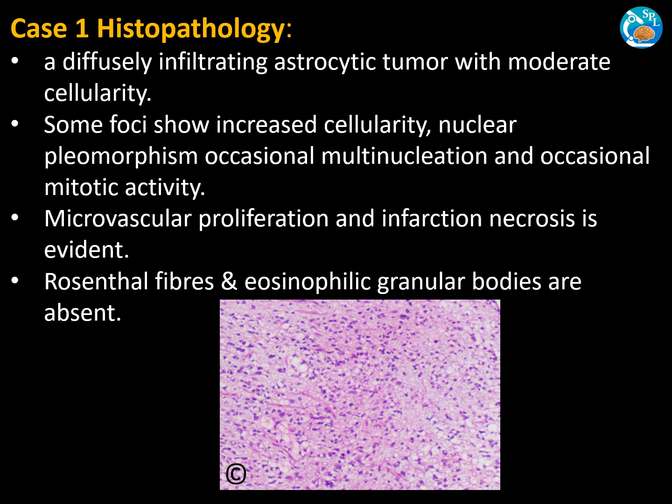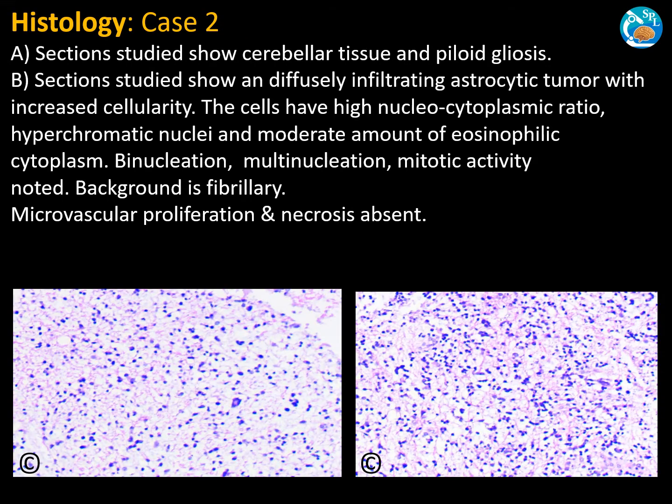Some foci showed increased cellularity, nuclear pleomorphism was noted, occasional multinucleation was noted, and occasional mitotic activity was seen. Microvascular proliferation and necrosis were also evident. Rosenthal fibers and eosinophilic granular bodies were absent.